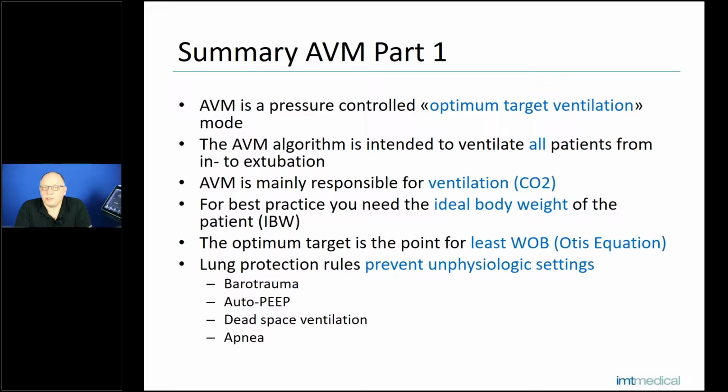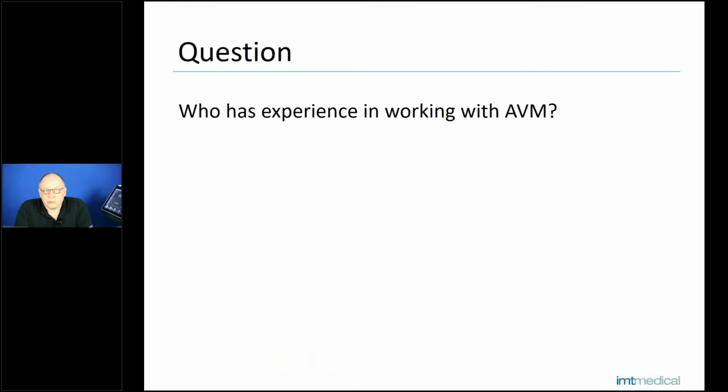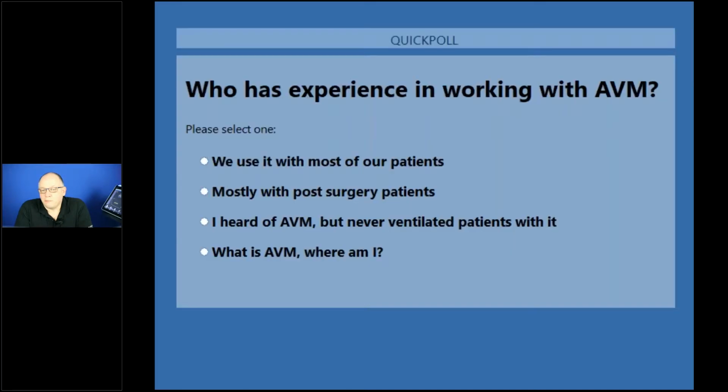Okay. First, a question before we really start with the second part today. Who has experience in working with AVM? We have 4 answers provided for you. We use it for most of our patients, so you have experience. We mostly use it for post-surgery patients. You have heard of AVM, but you never have worked with AVM. Or you have never heard of AVM before, and you really don't know what you're doing here today. But all of you are welcome, so let's see where the answers go. The poll is open now, and we are collecting the answers.